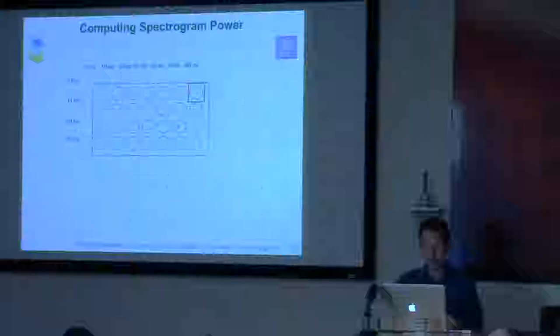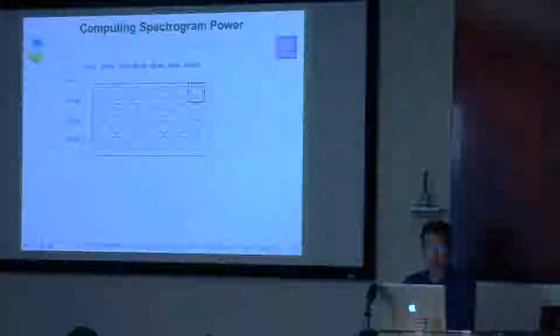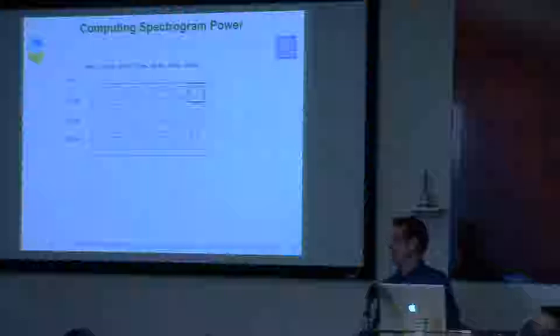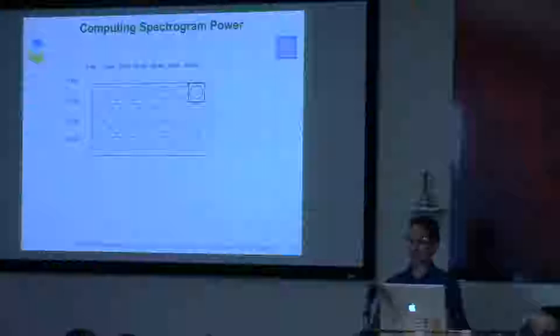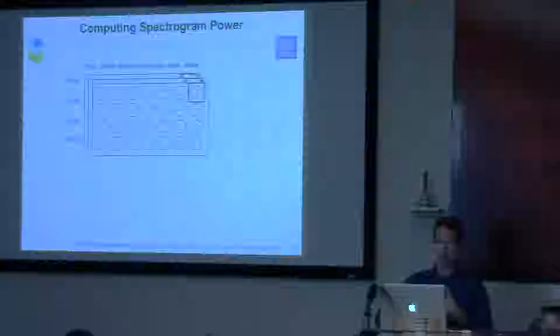So if we do that over a series of sliding windows, represented here with time going along the x-axis, for each window we get a complex number for each frequency band that we analyze, here 5 to 30 hertz. So you can think of this as basically a two-dimensional complex value matrix. What we typically do in EEG, in event-related analyses, is to do this spectrogram for each window that we've taken from whatever our event of interest is. So we can imagine a stack of those spectrograms. And to actually compute what we think of as the spectrogram, we'll just average across those.